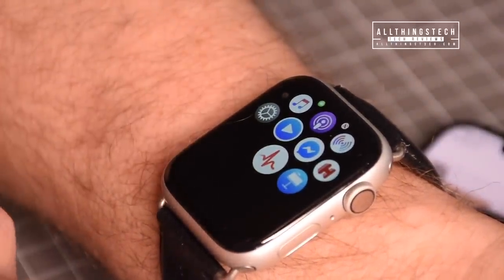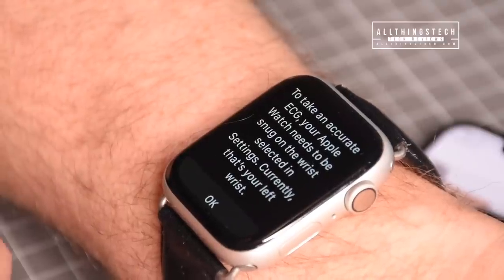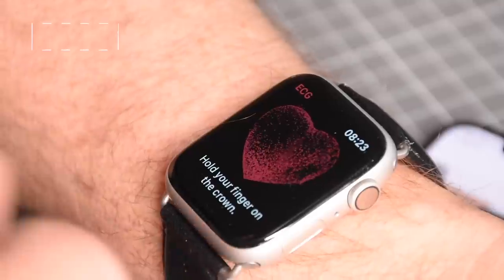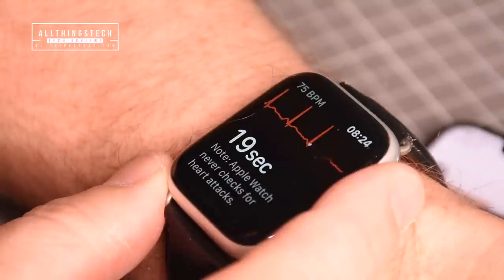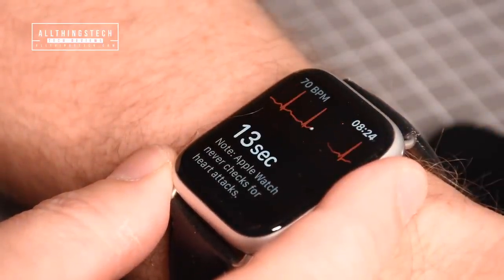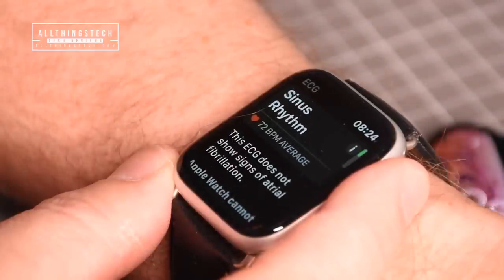Head over to your Apple Watch and find the ECG app, then click into it. You'll be prompted with a screen to take an ECG — your Apple Watch needs to be snug on the wrist selected in settings. You can now hold your finger on the crown for 30 seconds. Make sure you hold it properly, because moving slightly will reset the 30-second timer.